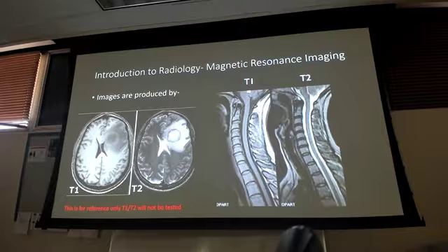That soft tissue just pops. On the CT, I'm not making all that out. We'll look at some spine CTs, and you'll see how you can't see the spinal cord. You know where it's supposed to be, but you can't separate it from the CSF. The soft tissue and fluid look the same.